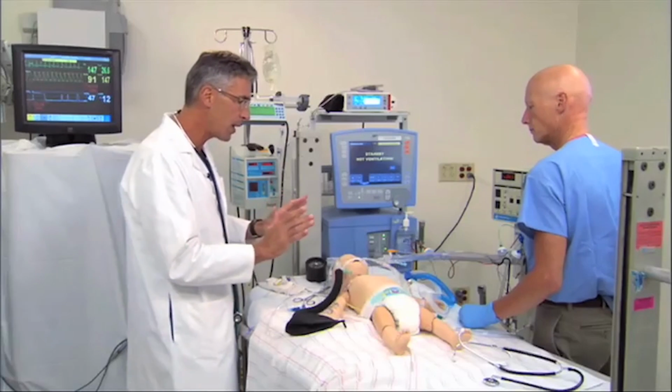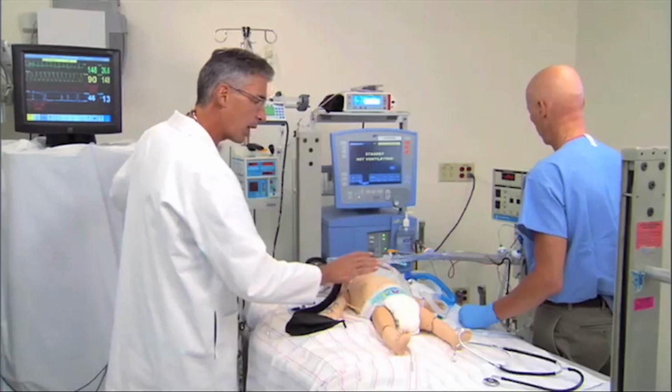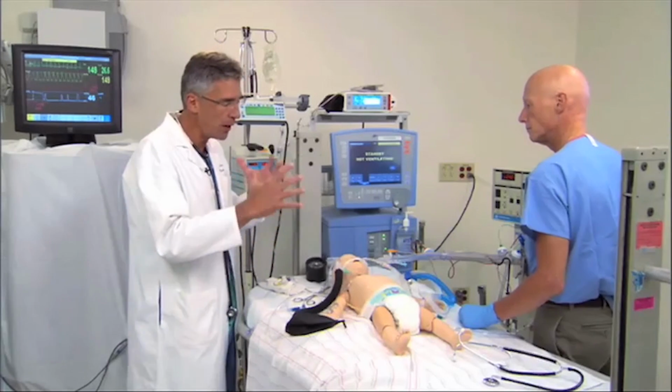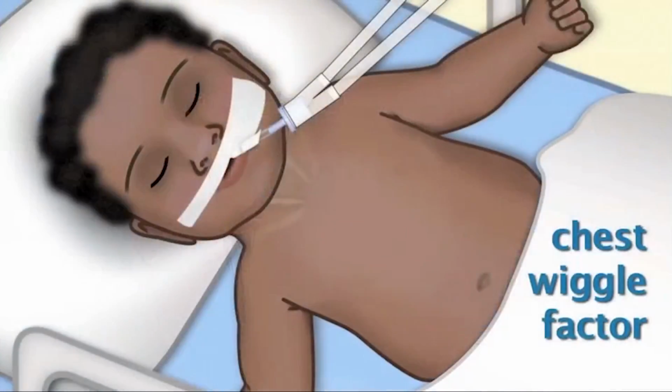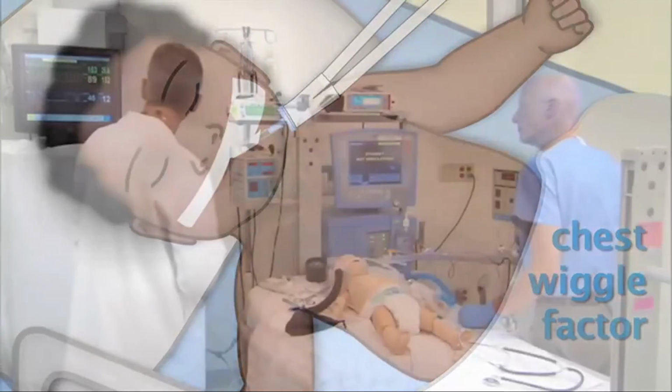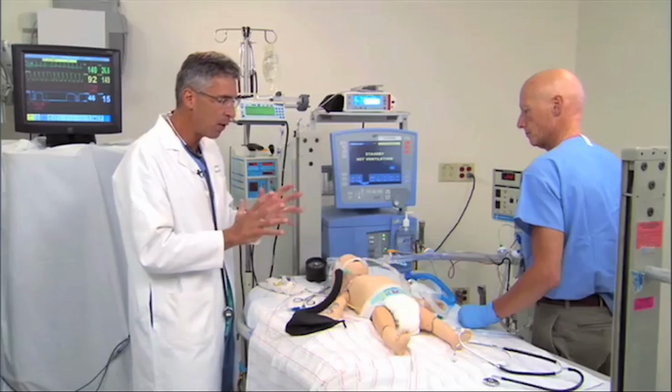Now the first thing to assess, besides the pulse oximetry signal, is the degree of movement of the rib cage, and we call this the chest wiggle factor. And so we're looking at Samantha's chest, assessing how much wiggle, in fact, is being produced. And I'm keeping an eye on the saturation. It looks like it's at 89% and staying there. So now we can focus a bit on chest wiggle.